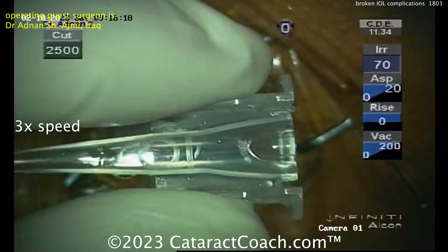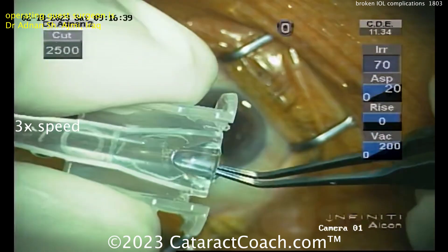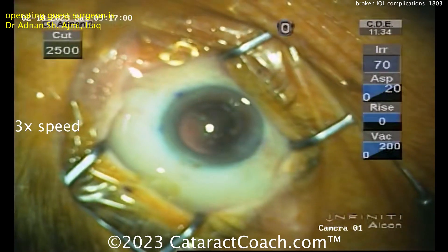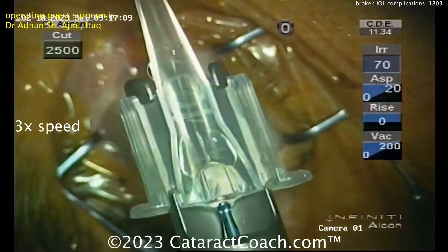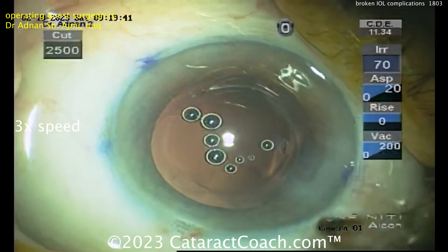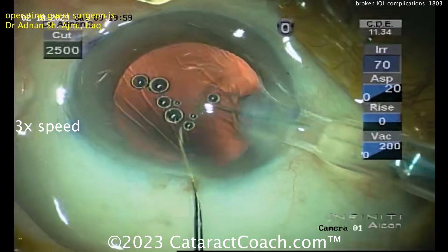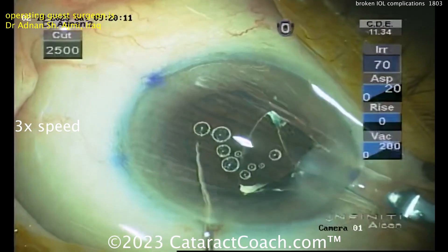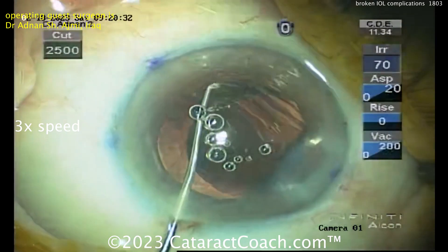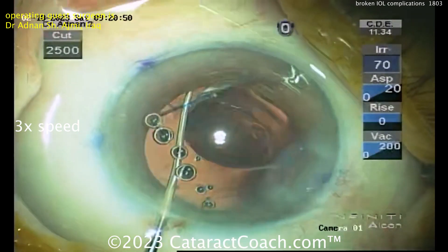Capture the optic. Here's the cartridge — the surgeon is going to load it up. There goes the lens. Getting the leading haptic in, there's the trailing haptic, being cautious not to get it damaged. Push the plunger a little and get it clicked in. The delivery of the three-piece lens — you know there's going to be some action here. You know the 7L rule: the leading haptic should look like the number 7 as it goes in. Lens goes in, correct orientation, looks good. Deliver the optic — and whoa, what's that? Where is the trailing haptic? It's still stuck in the injector. The trailing haptic is in the injector.